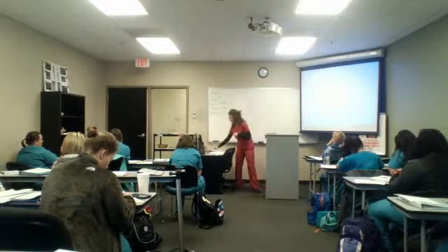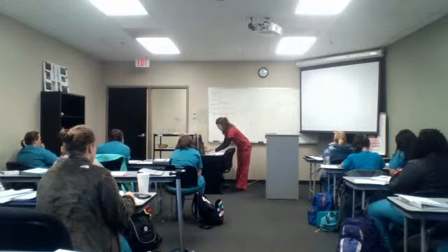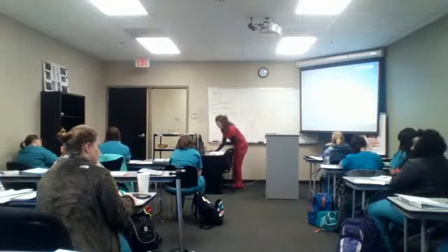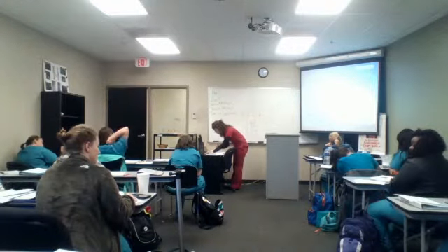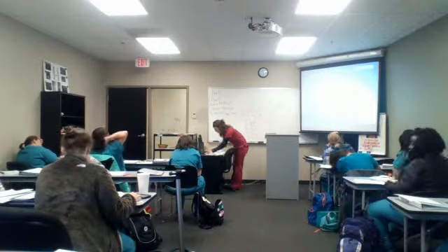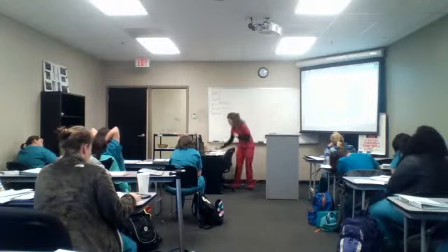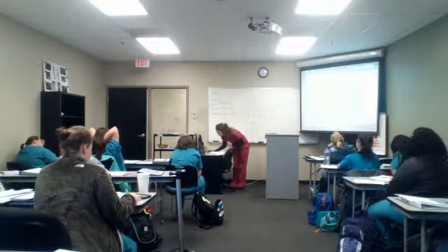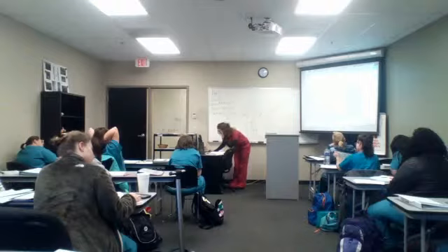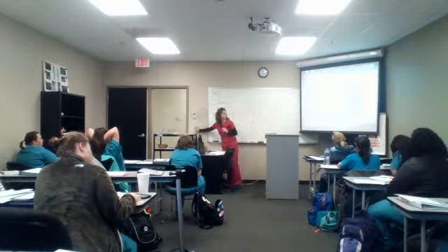And there should be a picture, because they do augment right here. So let me show you that. All right, so augmentation means you will compress distal to your probe. You're acting as a pump, squeezing blood out of the distal part up the leg. Okay? Oh, where is a good augmentation picture? Oh, here's a beautiful augmentation picture.